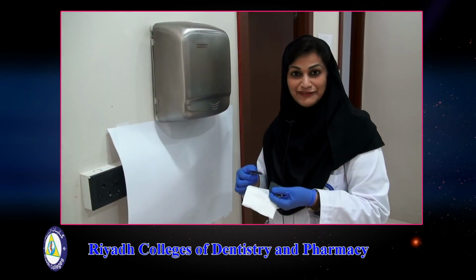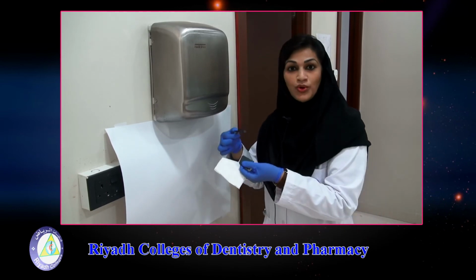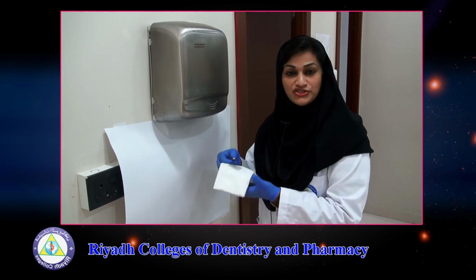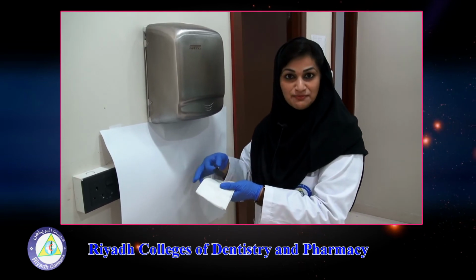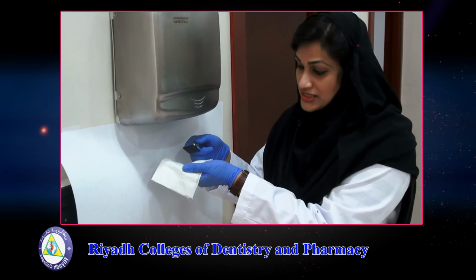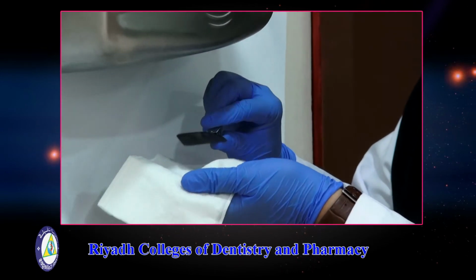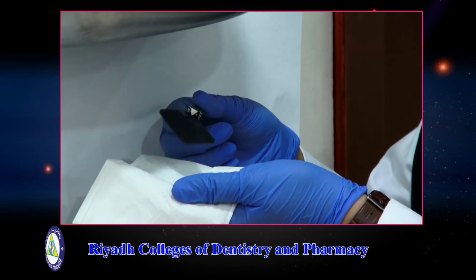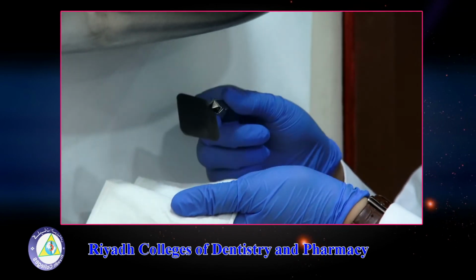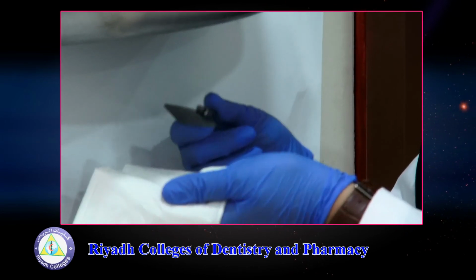Once the X-ray film which is wet is removed from the daylight processor, now you are going to dry the X-ray film. So when you dry the X-ray film, make sure that no water is spilled onto the wall. You have to dry till no water droplet is left on the film on both the sides of the X-ray film. If a water drop remains on the X-ray film, it will leave a mark on the X-ray film, which is again an X-ray film error.